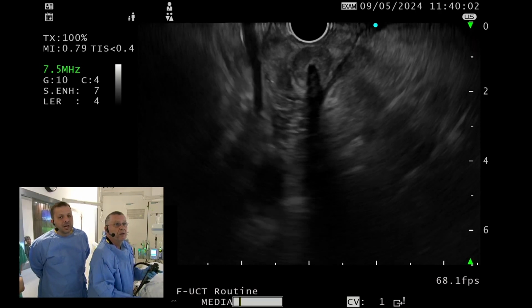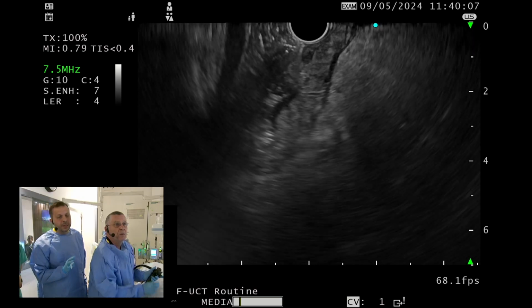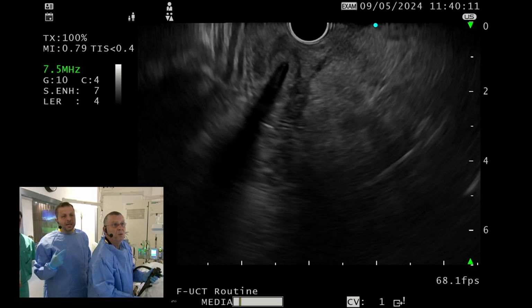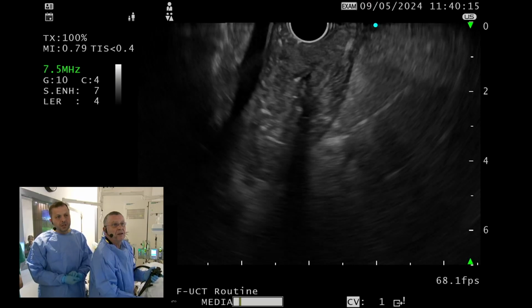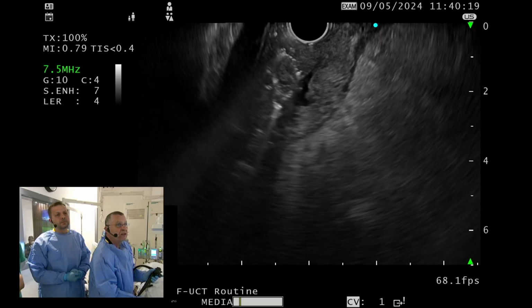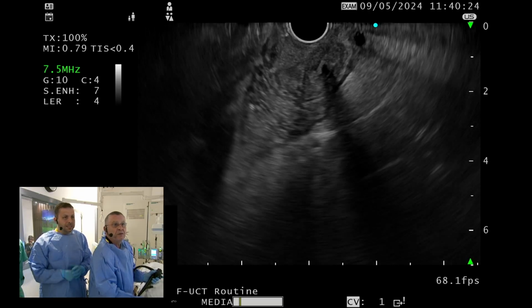Yeah, but we were talking also, guys, before the case that this patient presented with painless jaundice, and that by itself really speaks against the benign nature of this lesion. Yes, you have to be very, very careful if you have jaundice, which is not cholangitis, but jaundice, not if you have sludge or stones.